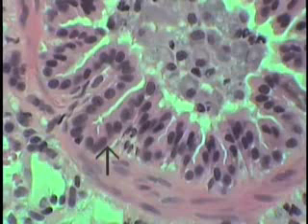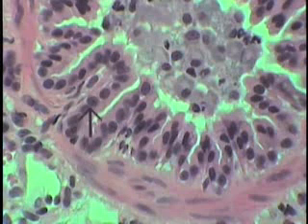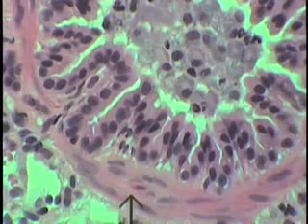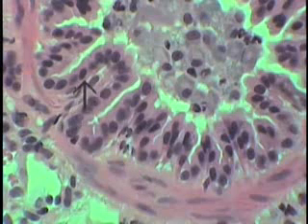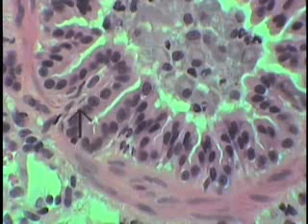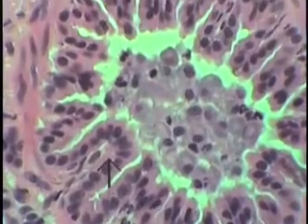The previous bronchiole as seen at high magnification, illustrating the folded nature of the mucosal surface to the luminal wall and the supporting wall of smooth muscle, which extends from here to here. And one can visualize there's just a slight amount of lamina propria supporting the overlying epithelium. Note that the epithelium is simple columnar in nature. A few scattered ciliated cells are present.